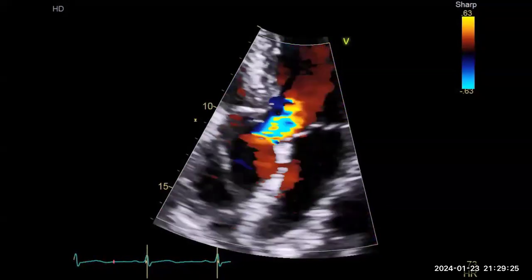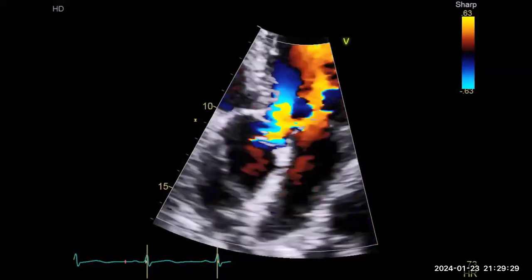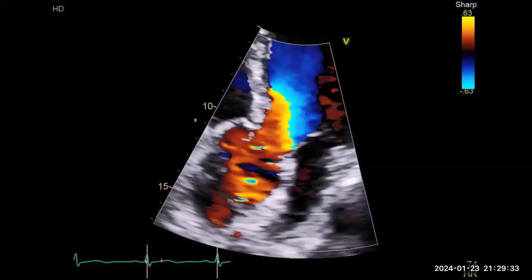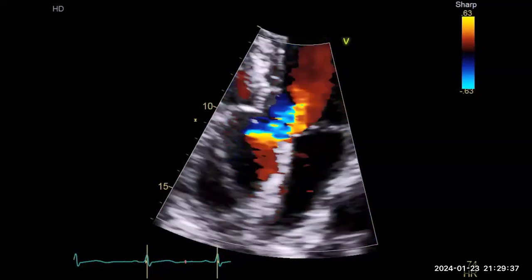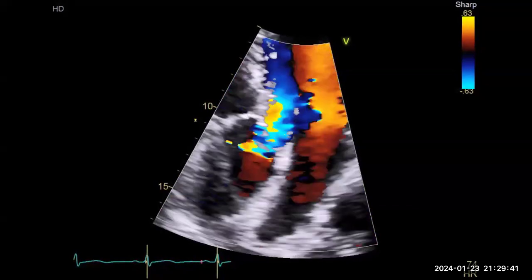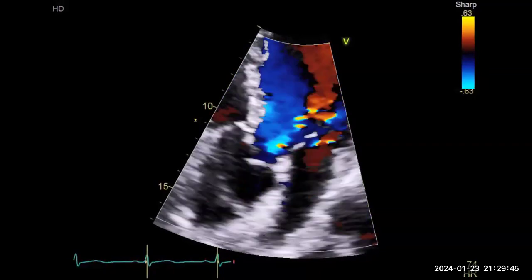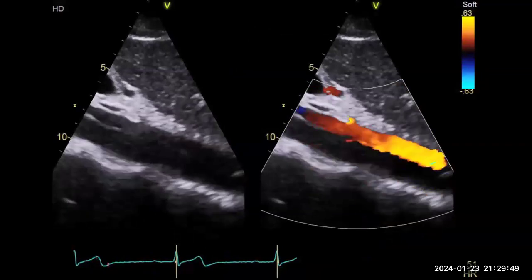Suprasternal. Other? And also I need to look at the mitral valve, if there is mitral valve prolapse in Marfan syndrome, so I can comment on it. Excellent approach, Abdulrahim. One more thing is the abdominal aorta during the transthoracic.